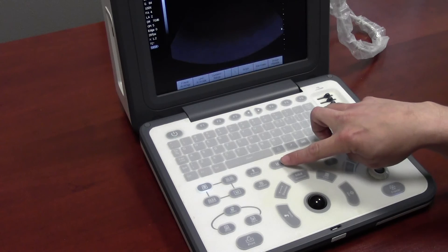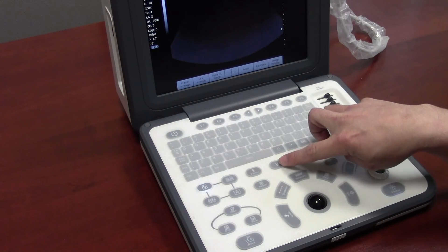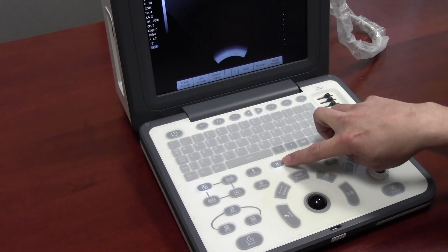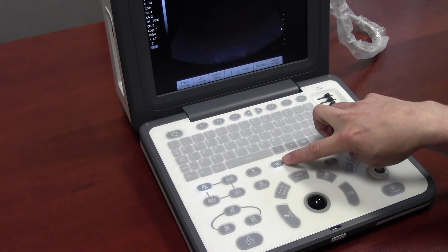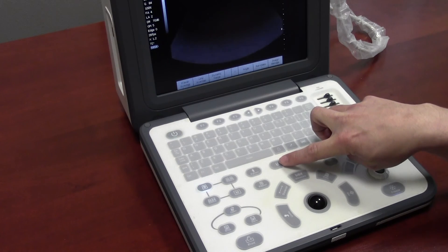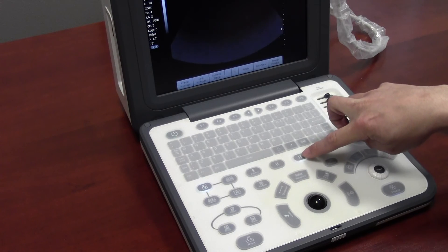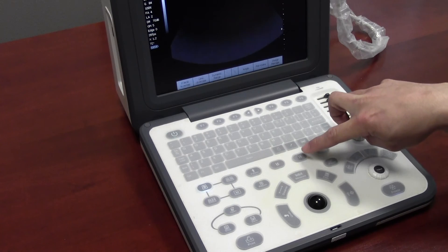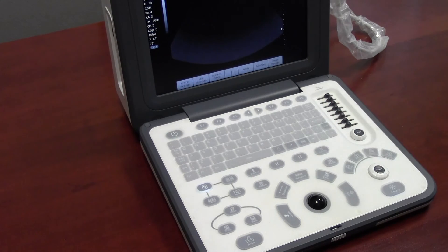You can invert the orientation from top to bottom by pressing the left R key, or left to right by pressing the right R key.